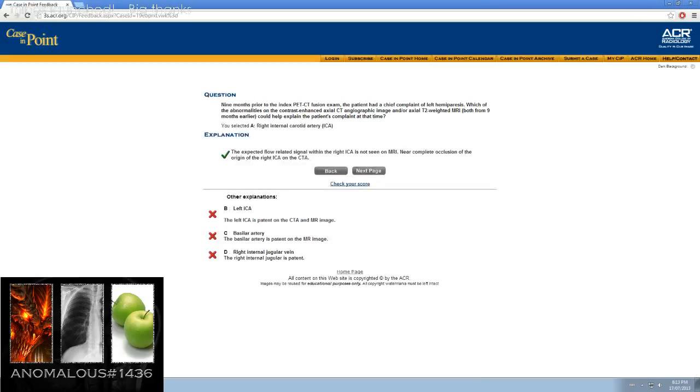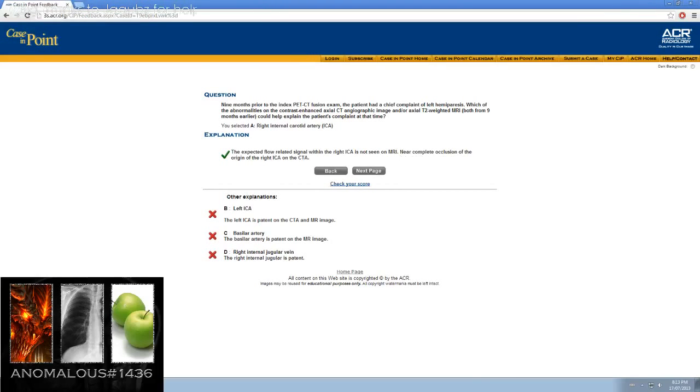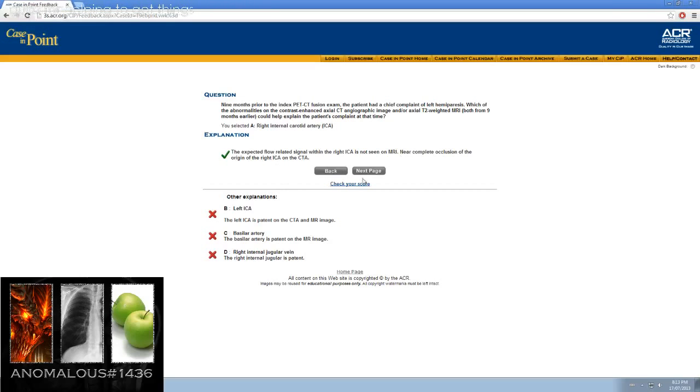The expected flow-related signal within the right ICA is not seen on MRI. It should have been black. Near complete occlusion of the origin of the right ICA on the CT.